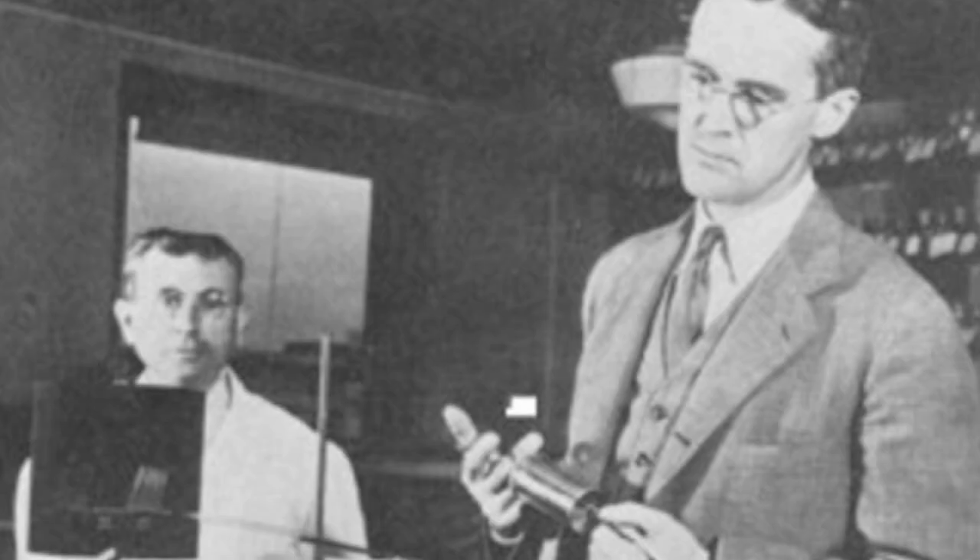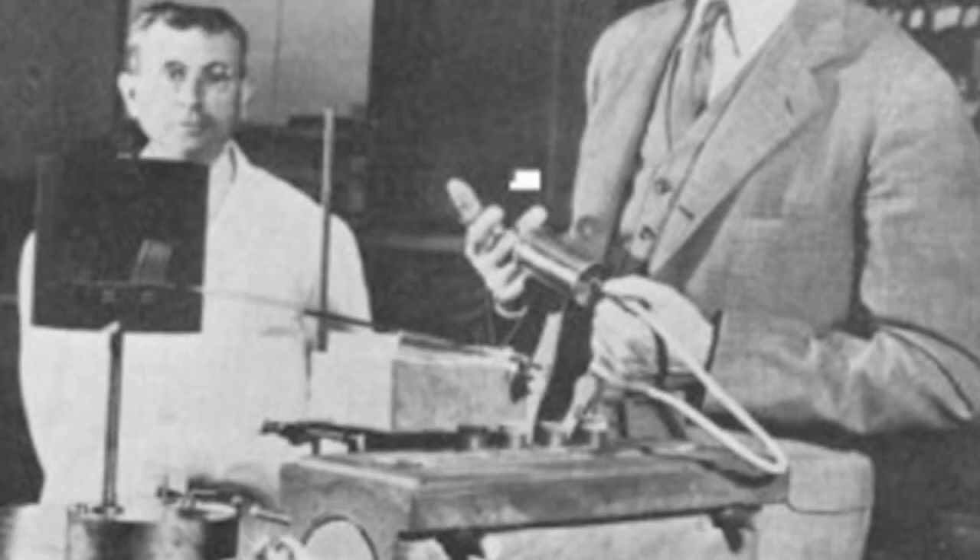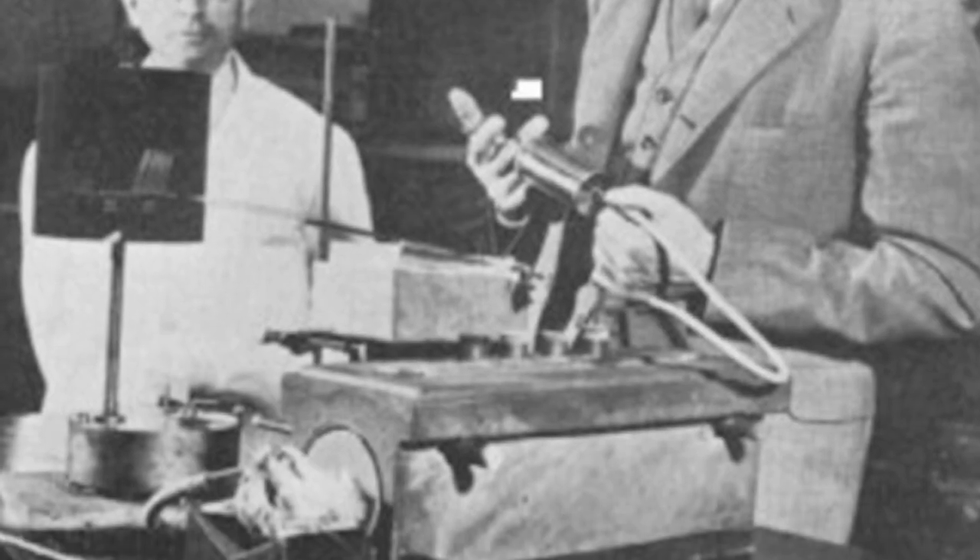Devices similar to the iron lung have been around since the 1830s. Philip Drinker and Dr. Lewis Shaw were the first to use the term iron lung to describe their machine in 1928. It was used widely in the polio epidemic that year.